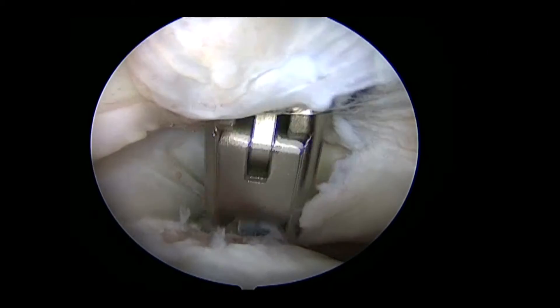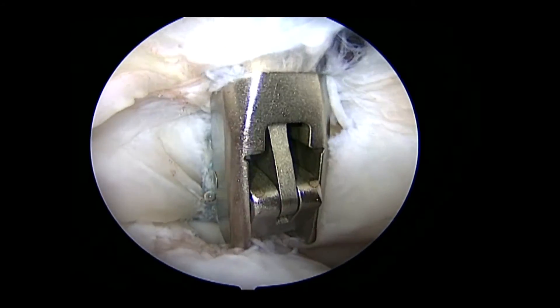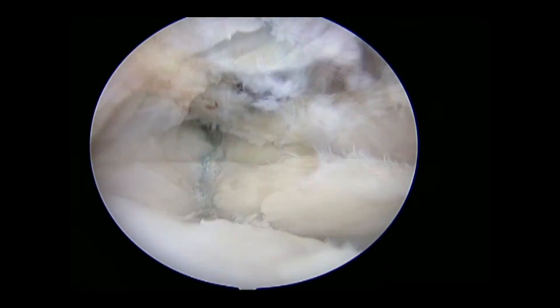The sutures are then cut flush and a dynamic exam can be performed to reassess stability.